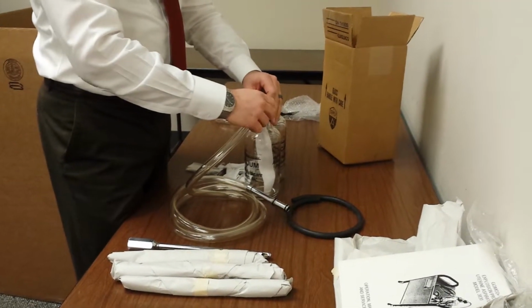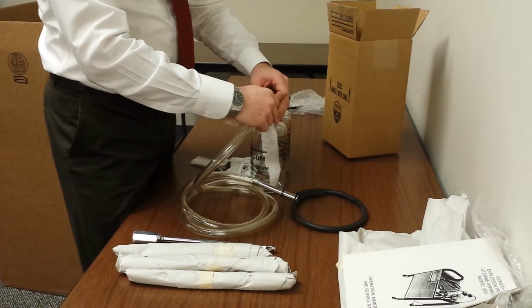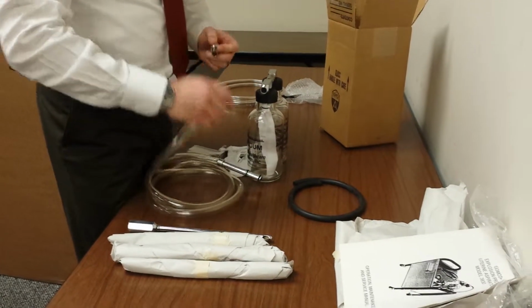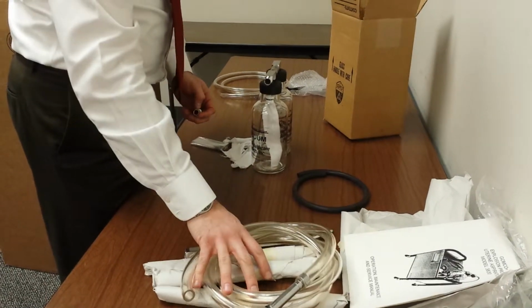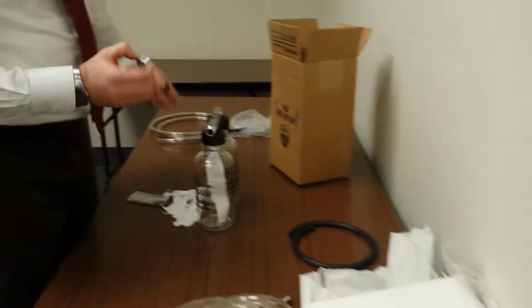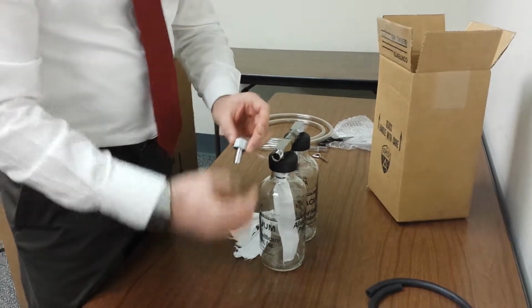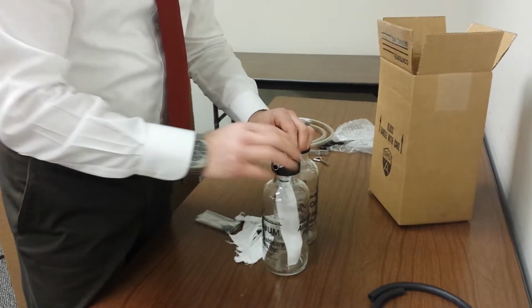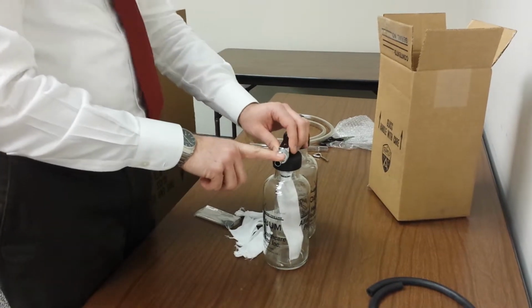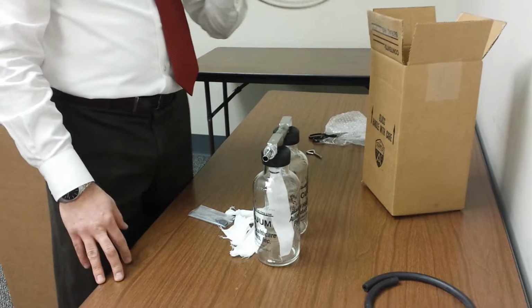Now, in certain cases, or more commonly in the United States today, clinicians want to use disposable tubing sets. If you want to use a disposable tubing set, you really won't use any of these pieces here. You won't need the 1/2-inch either. What you'll use is the 3/8-inch tubing adapter, and you'll simply install that instead of the 1/2-inch. That allows you to use 3/8-inch tubing, which most of the disposable curette tubing sets out there are designed for.